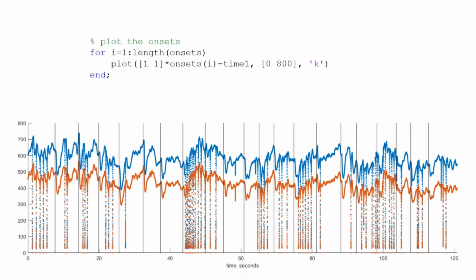We expect a strong hypothesis that during a brighter stimulus, the response will be stronger. The constriction of the pupil will be greater. How to do it when we have a continuous recording of the pupil with some presentations of the stimuli with a random variation of the interval between them?